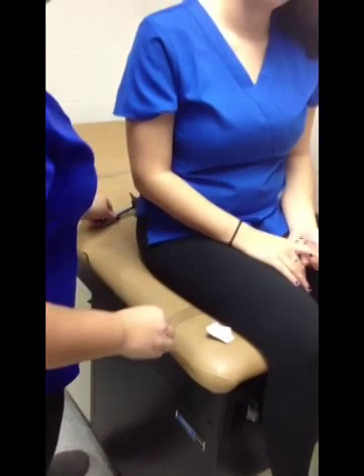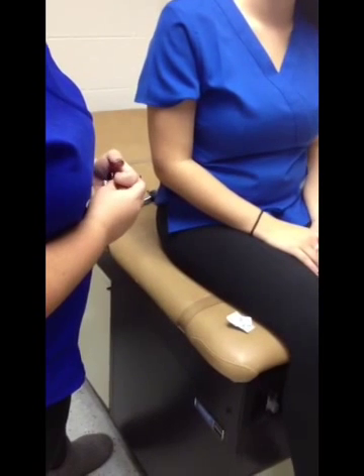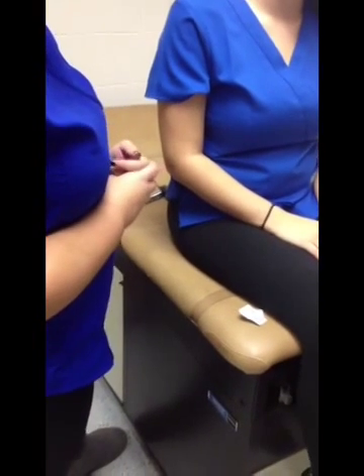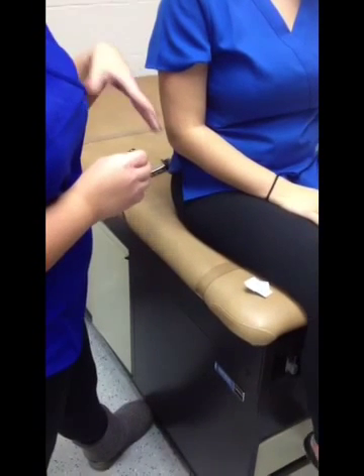If it's red or yellow and it's opaque and bulging, then you may have an infection in the middle ear, which is known as acute otitis media. In extreme cases of acute otitis media, the eardrum may burst, which will let go of the pain and the pressure.